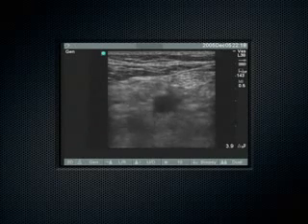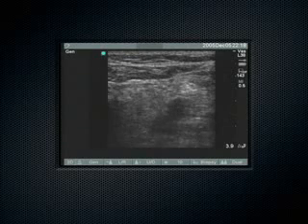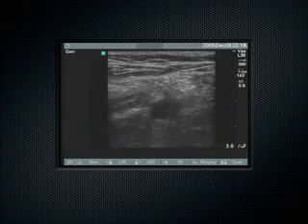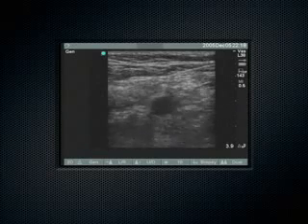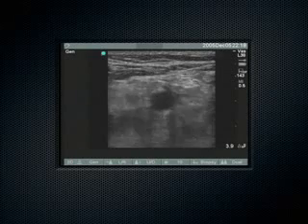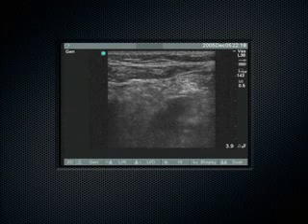Where are we? Hard to know. Turns out, now you know. See that? This kind of gets at the Frank Netter drawing a little bit, actually. Interesting, after I told him that you don't see this. I'm going to pause it when it becomes clear where we are. And so we're pushing right there, and then there. So this is the popliteal fossa. Good.